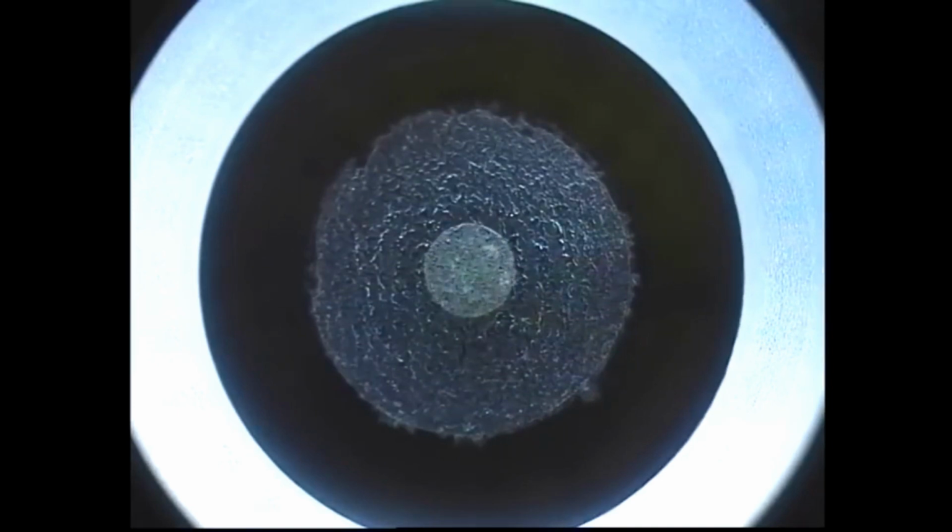So that's where you go, good contact, and once the contact is maintained, you apply suction, which is about 60 millimeters of mercury, and once that is adequate, you go ahead and press for your laser. So laser starts. Here you see the micro bubbles we mentioned before. So you start from outside to inside. So it is producing one layer of dissection, and the second layer of dissection is going to be the second wave going from inside to outside. So in this way, you've actually dissected a lenticule, of which one cut is superficial and one is deep.